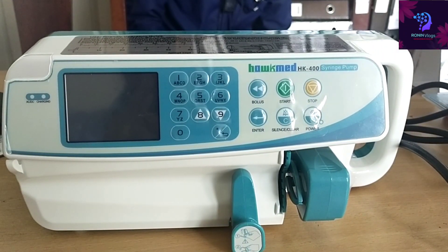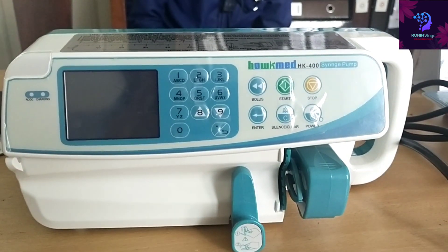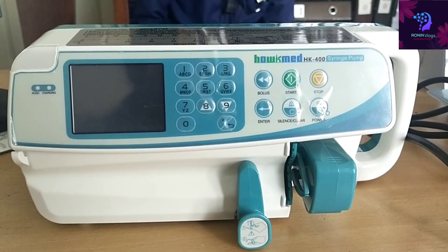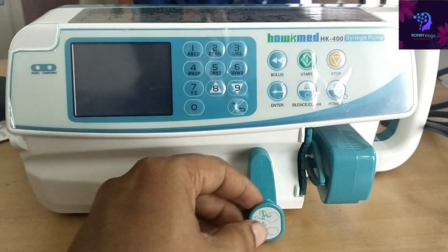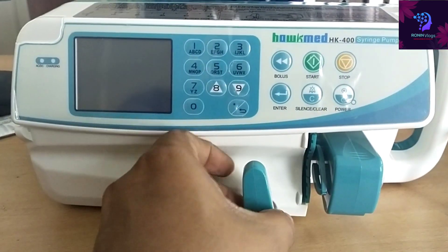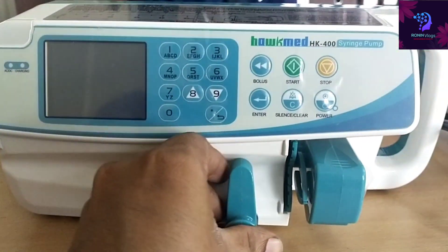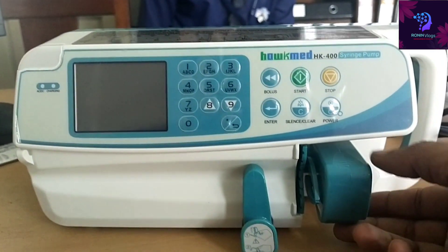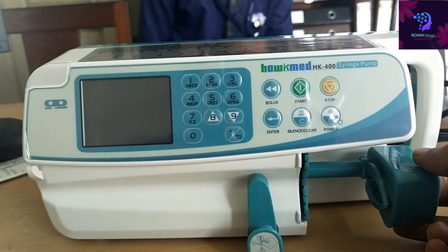Hello friends, welcome to my YouTube channel. Today in this video I am going to show you about the Hawkmed HK400 syringe pump — budget friendly, easy to use, and user friendly.